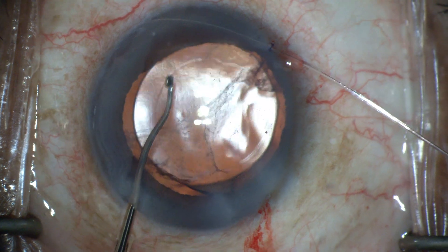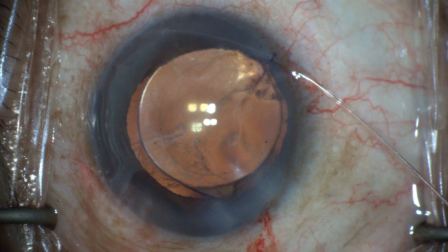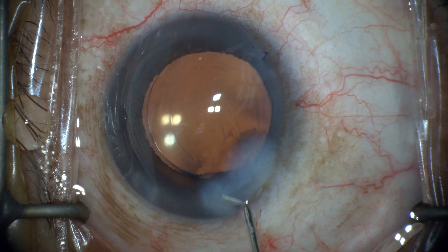Once 50% removed, resistance on the microcatheter is reduced and the Kuglin hook is no longer needed. Aspiration of viscoelastic, stromal hydration, and repressurization of the anterior chamber complete this procedure.